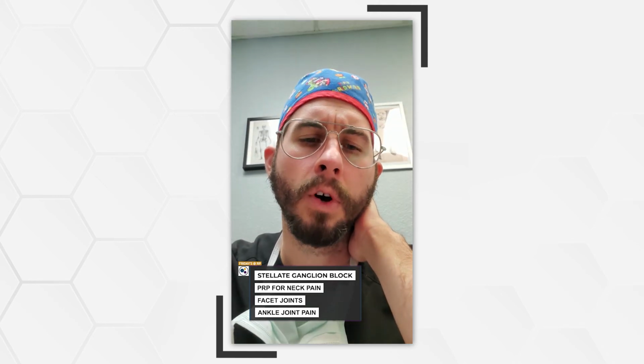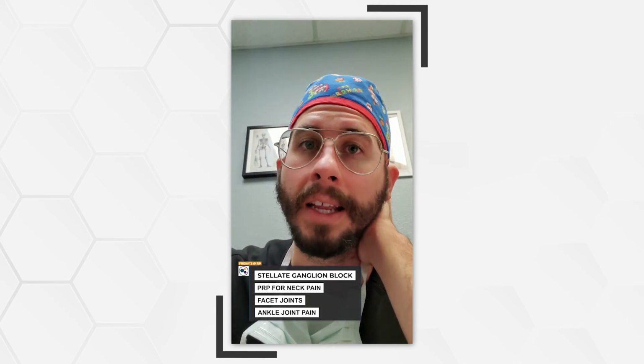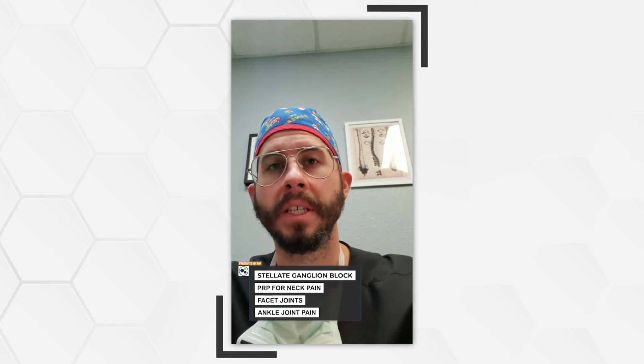And then the last case, we did an ankle PRP, and specifically we did a nerve hydrodissection of the sural nerve, which is the main nerve that runs down the lower portion of the calf right over top of the Achilles tendon. So patients who have Achilles pain very frequently have some inflammation in that sural nerve. So we hydrodissected that. Then we put some PRP into the fat pad. And then it also appeared that the fat pad was sticking a little bit to the underside of the Achilles tendon, and so we hydrodissected that apart.